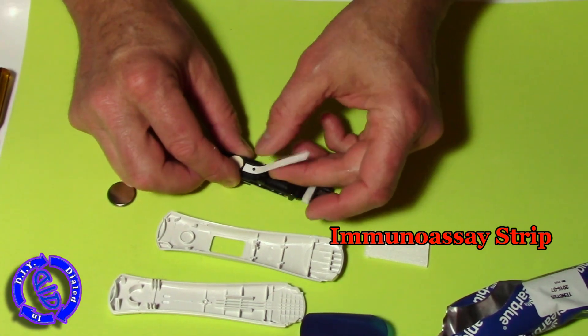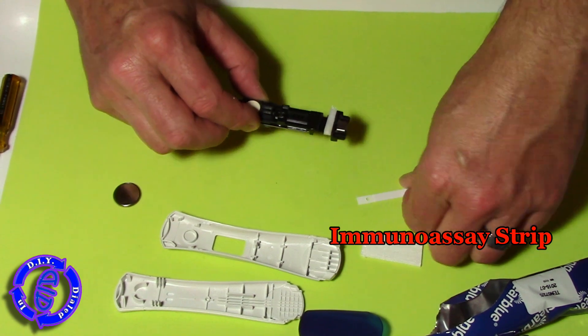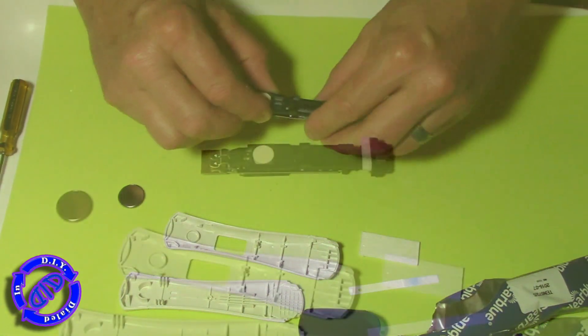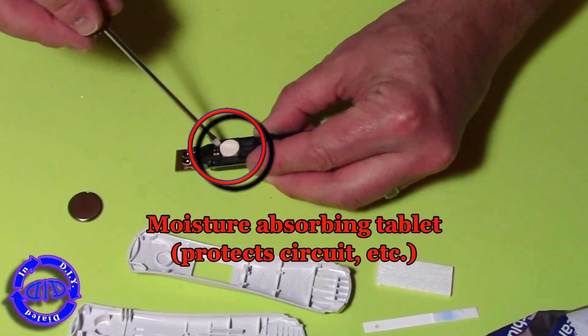And that brings us to the test strip, which is actually coated with monoclonal antibodies that are specific for HCG. This is much like every other pregnancy test out there, and when it gets moist with the right kind of fluid, it will show up with either a positive or negative result.